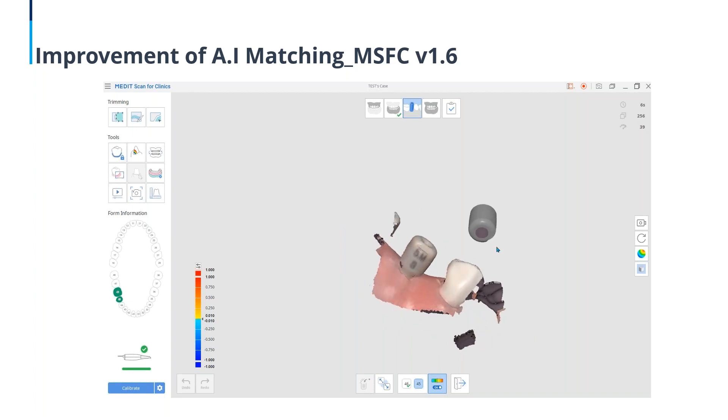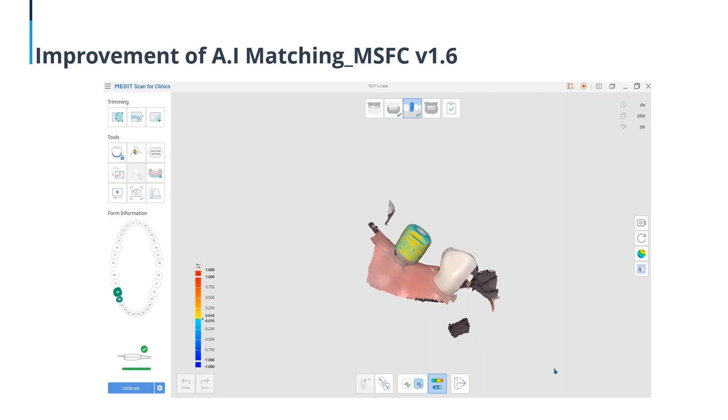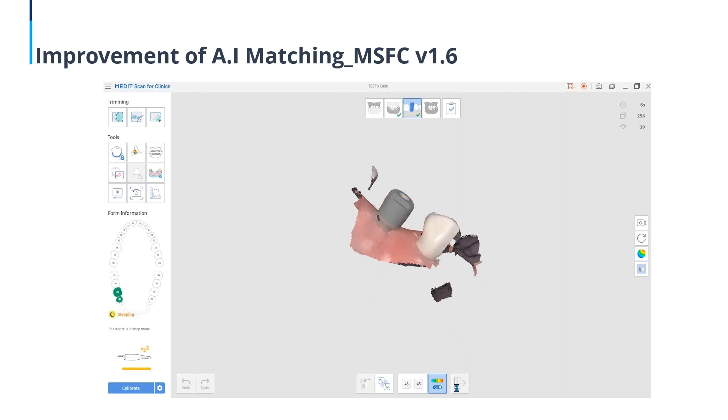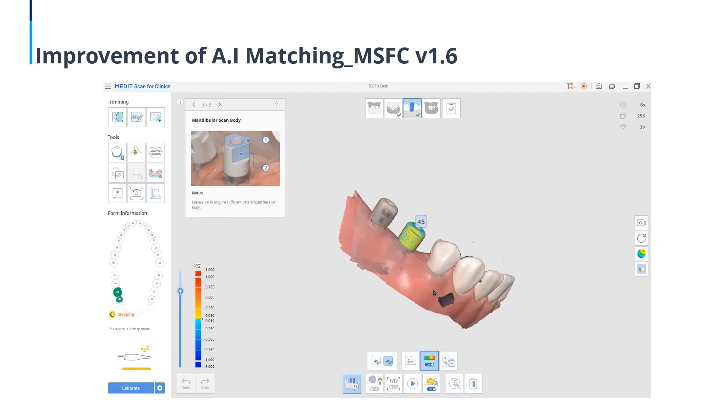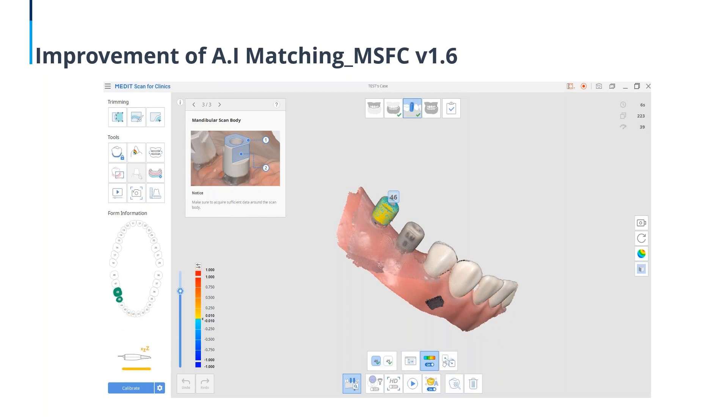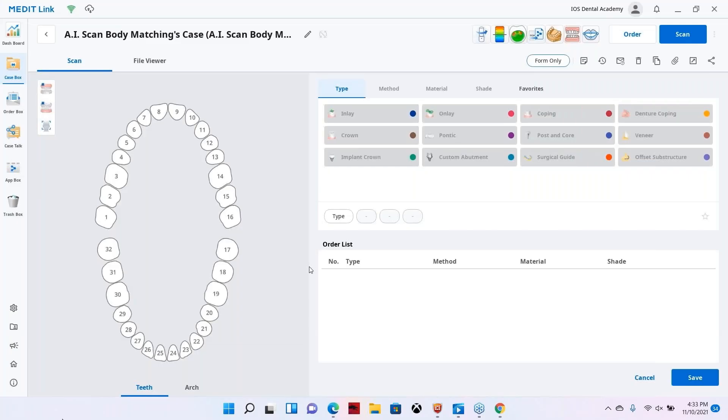We're going to go ahead and align this using the single point alignment. And then we'll align our second scan body now using a three-point alignment. By exiting at the bottom, then you can go ahead and view your two scan bodies together. You can click on the selected scan body and implant site there at the bottom. So this is a review of the AI scan body matching tool prior to the update. Now what we're going to do is switch to our medit software and actually go through the software, scanning the soft tissue, scanning the scan body, and you're going to see the differences now in the update.